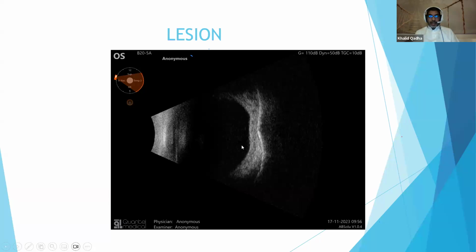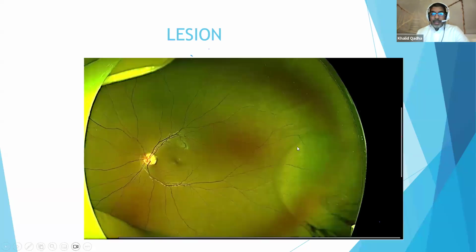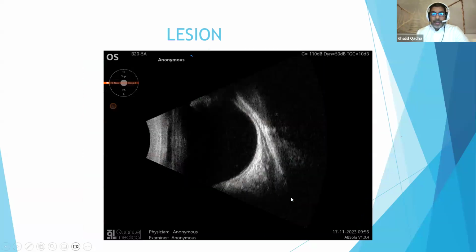This is the zygomatic bone, which is the bone on this side. The structure of the bone itself was on this side, this way. So it pushed the globe, and it caused, as you see in the image here, this elevation in the anterior part of the temporal side.